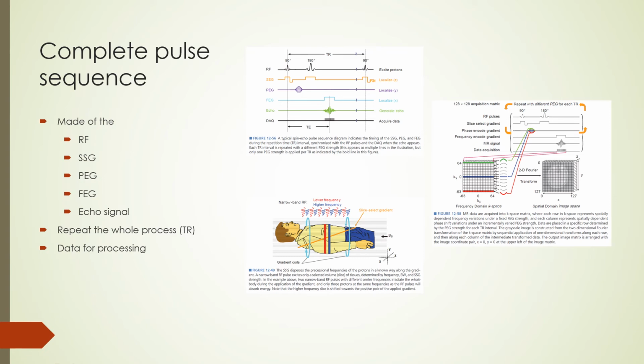Regardless of the orientation of the slice select gradient chosen, the phase encode gradient and frequency encode gradients are always perpendicular to the slice select gradient.